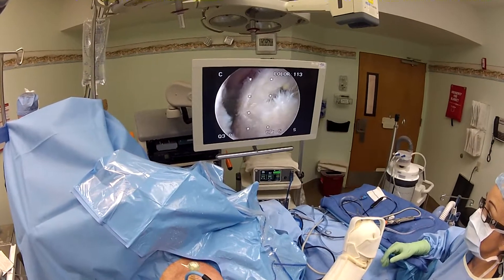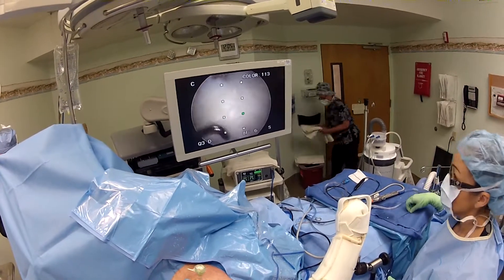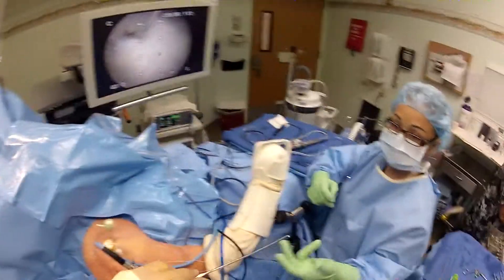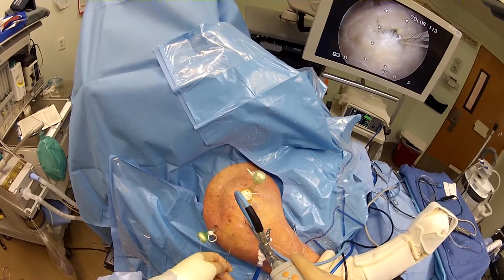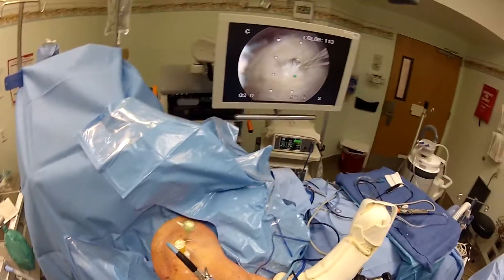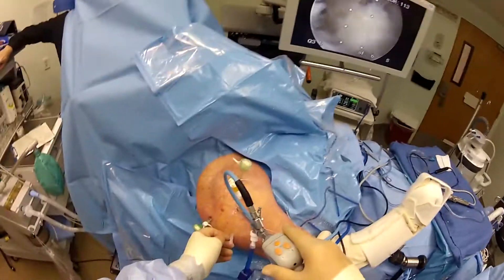Now we passed one suture back through here. Now I'm going to show you a little trick where we have poked through the skin — 18-gauge needle. So we'll come over here, try to get an angle. And there you go. See, we're able to come right in there.